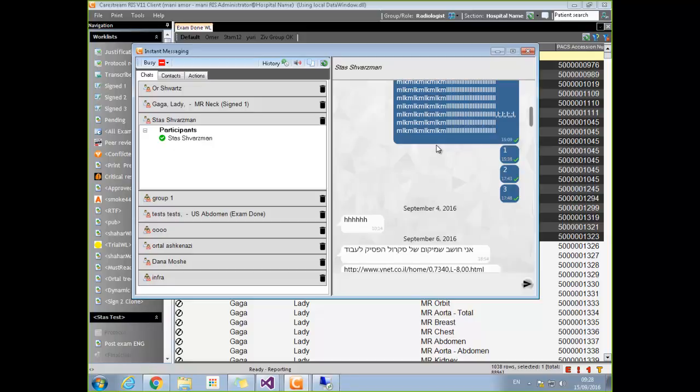Sending files exists from the central manager because we are sending the log files, so we thought to use the same technology. It's like a given. But for messaging, we are not going to invest more. There are other things we are thinking to use this technology for, like whiteboard and broadcast. It's an easy way to send messaging.